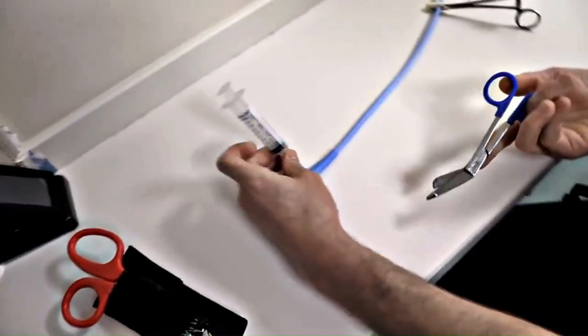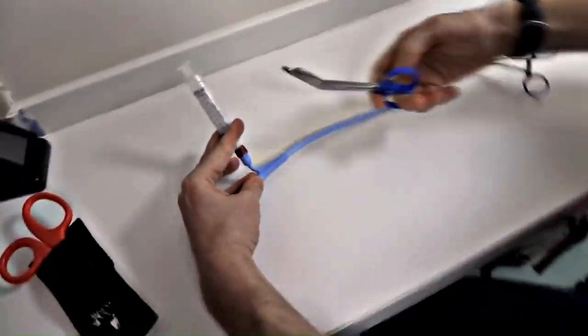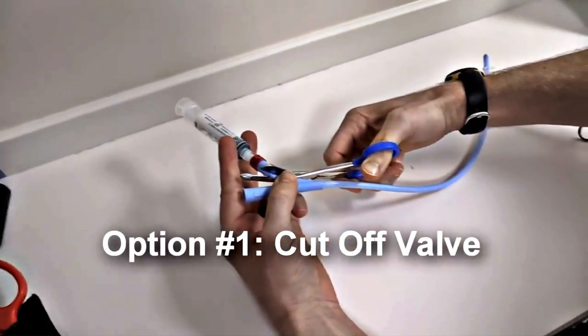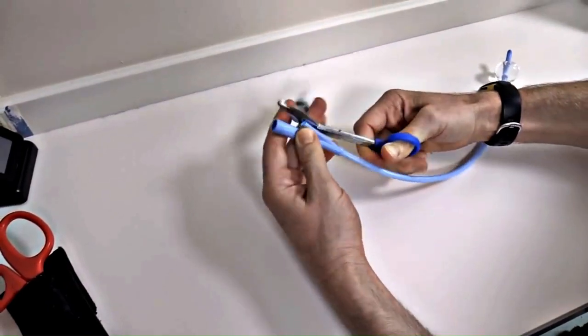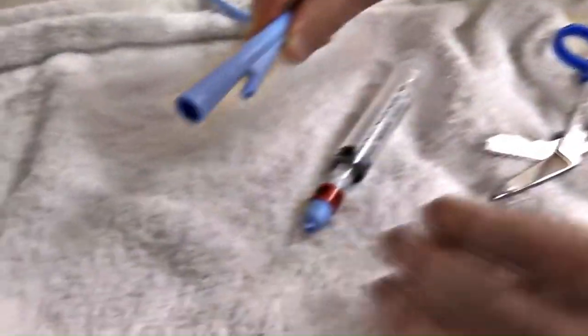After advancing, we're going to go ahead and cut the line. It is draining.